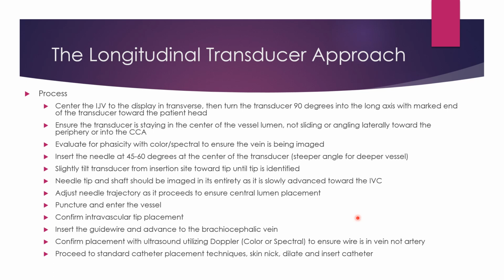So you can advance the needle, making mild adjustments to try and hit the center of the IJV as you go. Again, you're going to see a dent once the needle is close to the vein, and then you will puncture and enter the vessel.